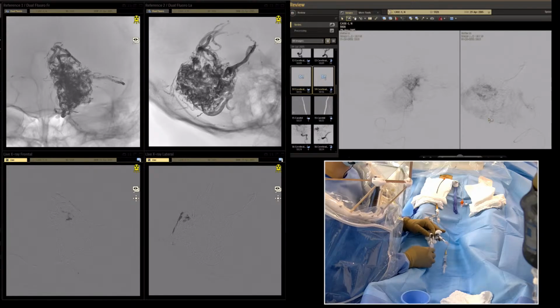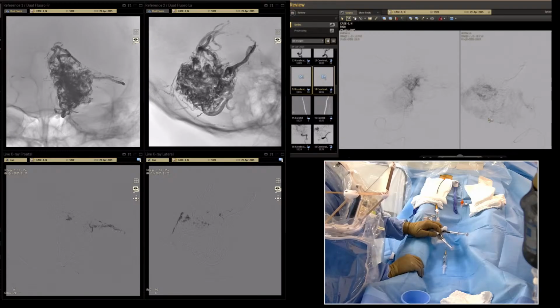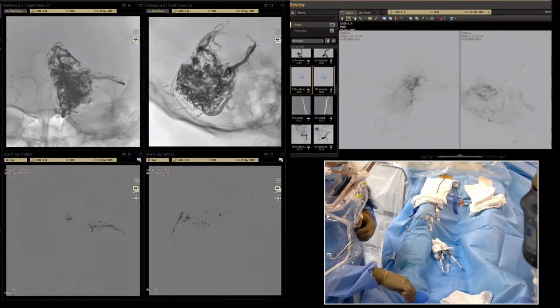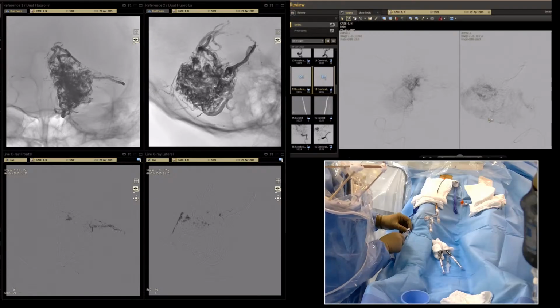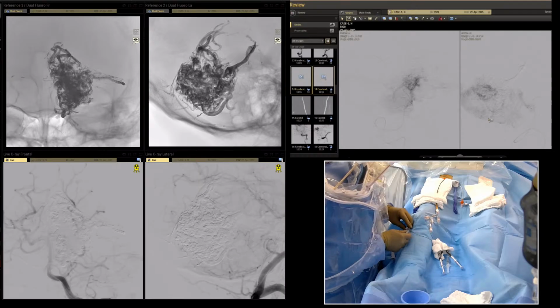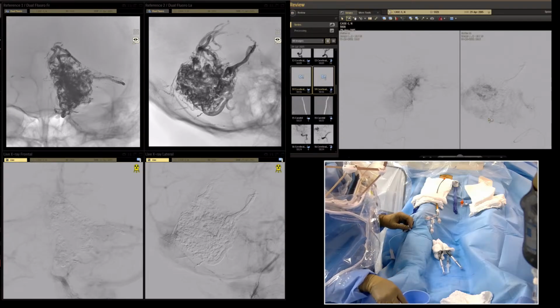And also the reflux. I have a reflux. There is a branch in parallel. It was a connection between two branches. We're still in the arterial territory and not touching the venous part.